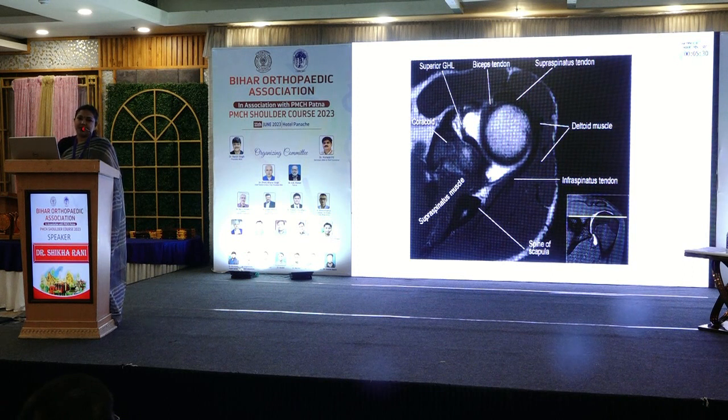One thing is that the muscle fibers look hyperintense relative to the hypointense structures like tendon, ligaments, labrum, and the fluid. If the patient is in pain or has any tear, then definitely there will be fluid. If there is less fluid, then MR arthrography will create the distension to locate carefully the different structures. Now from above, the superior glenohumeral ligament, as the sir has already told, the 3 glenohumeral ligaments: superior, middle and inferior.